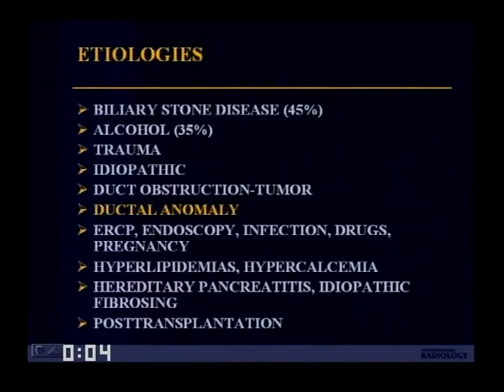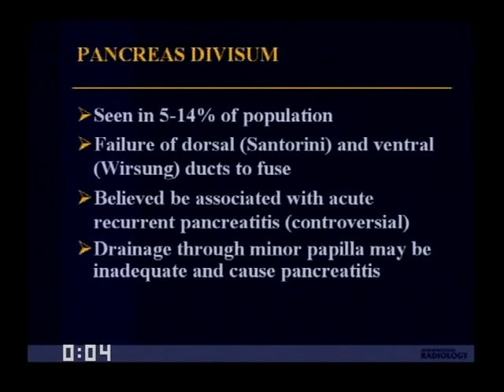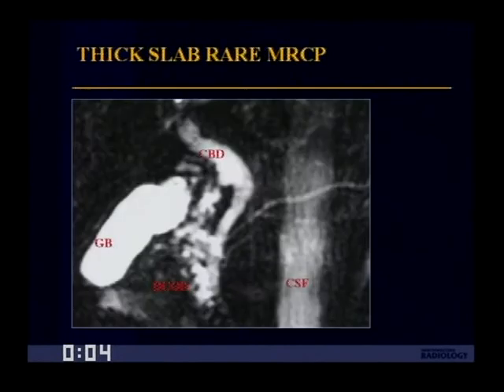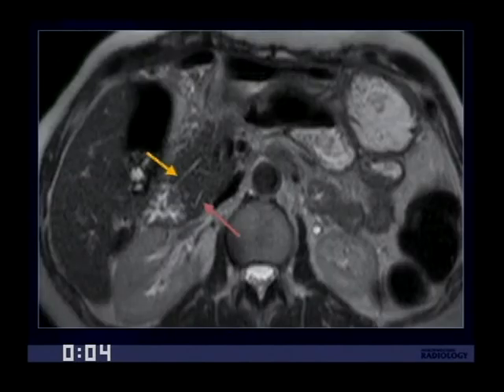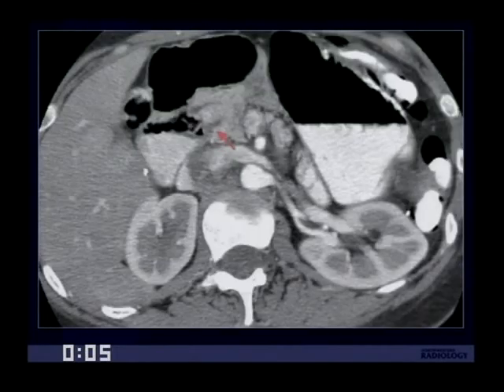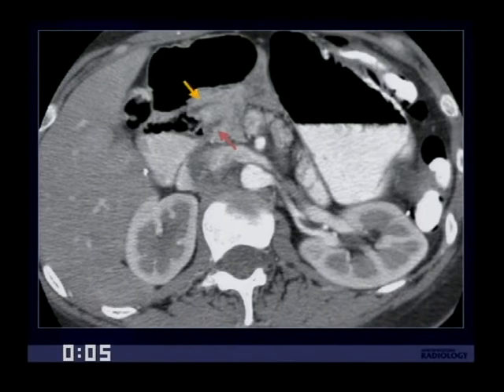Other etiologies for pancreatitis include ductal anomalies. For that we're often doing MR, but thin-section CT can also be used. The most common anomaly is pancreas divisum, reported in 5% to 14% of the population. It's due to failure of the dorsal and ventral ducts to fuse and is believed to be associated with acute recurrent pancreatitis, generally due to inadequate drainage through the minor papilla. Here's a thick slab MRCP showing pancreas divisum with two non-communicating parallel ducts, also visible on thin-section CT draining separately into the duodenum.